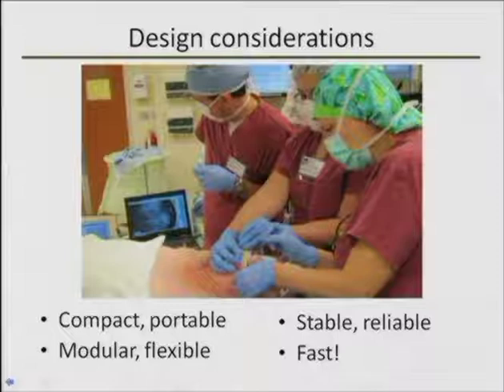I want to talk a little bit about design considerations for translational clinical studies. Now, keep in mind that I'm not talking about instrumentation that's going to be for treatment or that is going to be the primary focus of what's going on in the operating room. In this case, I'm talking about diagnostic instruments that are intended to assist and support the clinician in evaluating particular tissue sites, either before or during surgery or in the clinic prior to surgery, for example.